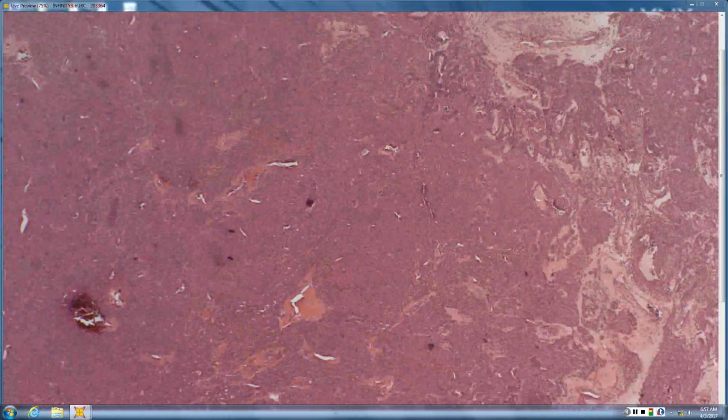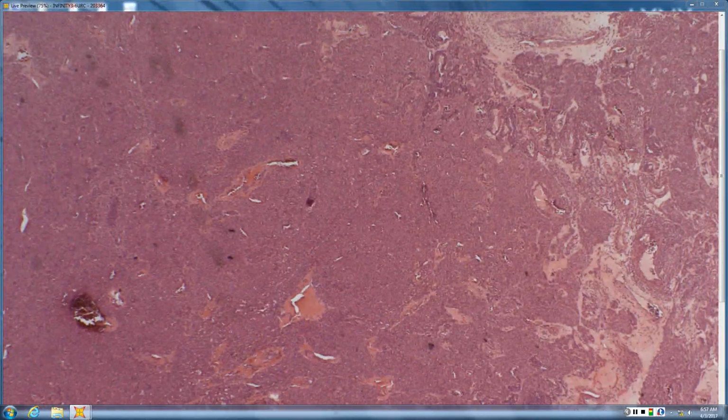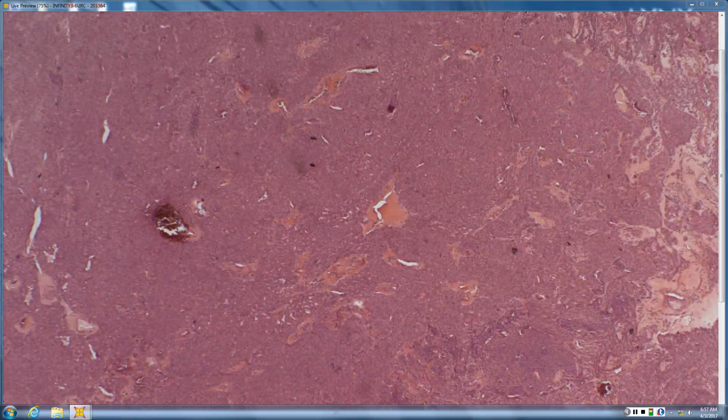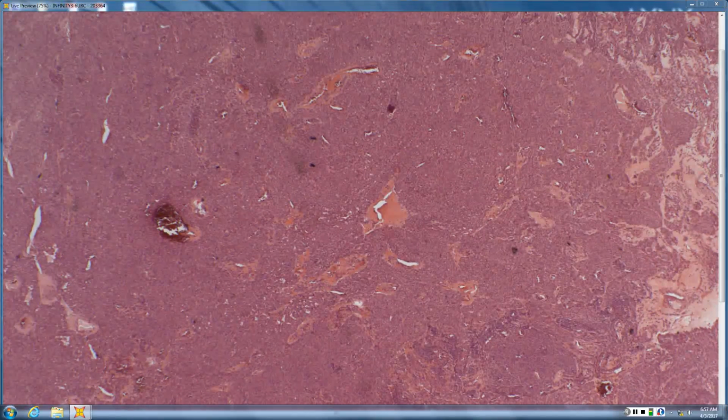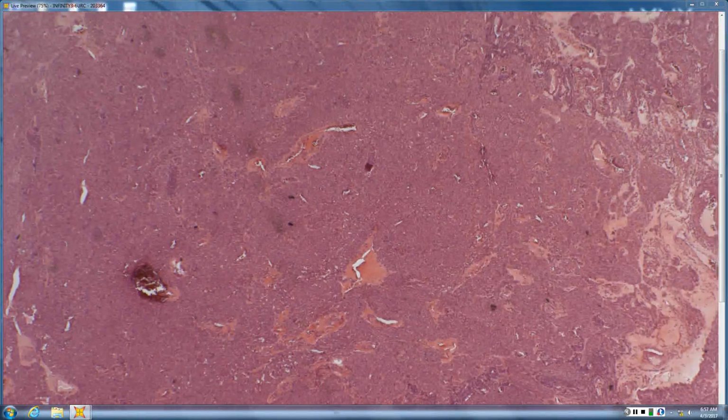This is number 4, and it is a glomus tumor. And I remember in derm residency, questioning, well, what's the cutoff between glomus tumor and glomangioma? Does it really matter? And certainly there are the two ends of the spectrum, two separate entities. When it's just sheets of glomus cells like this, it's very obviously a glomus tumor. Whereas when that vascular component starts to predominate, then it becomes glomangioma.